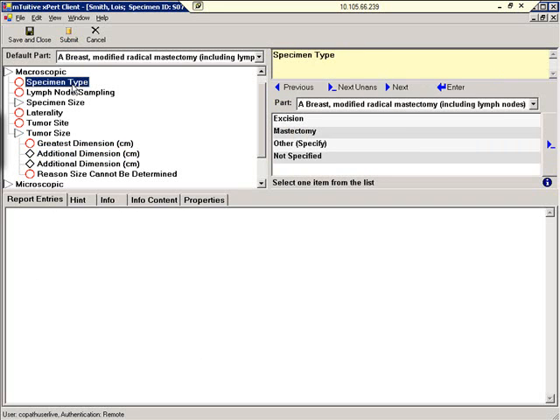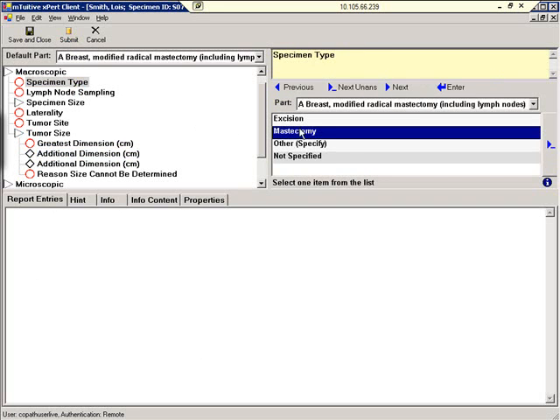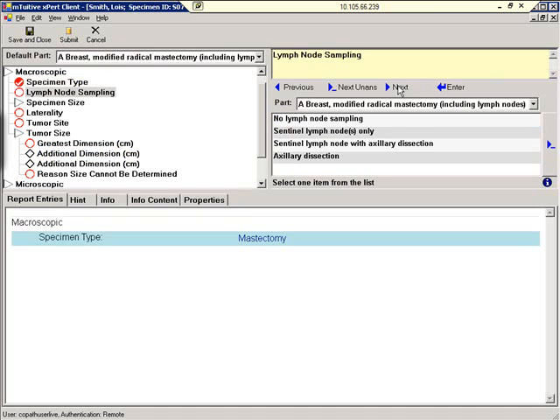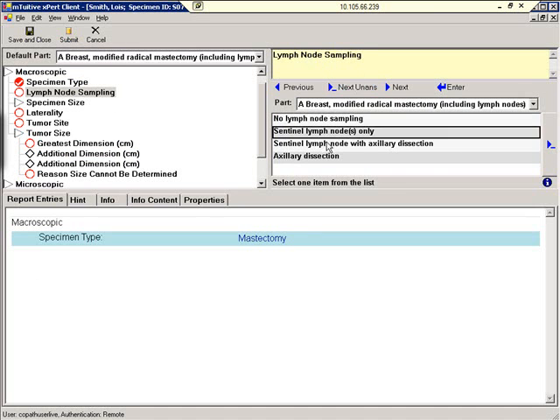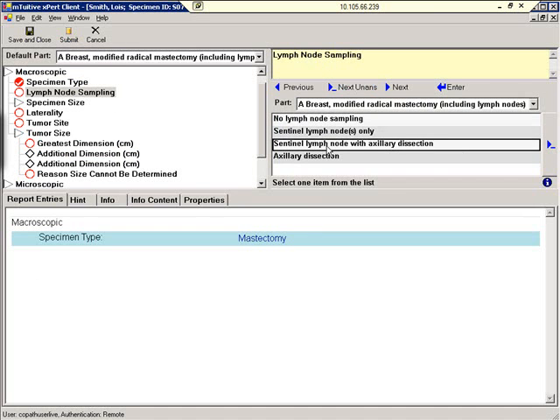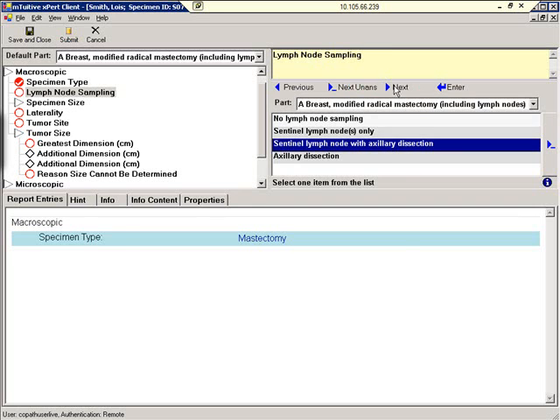We'll begin by selecting the specimen type. Mastectomy. Lymph node sampling. We'll select sentinel lymph nodes with axillary dissection.